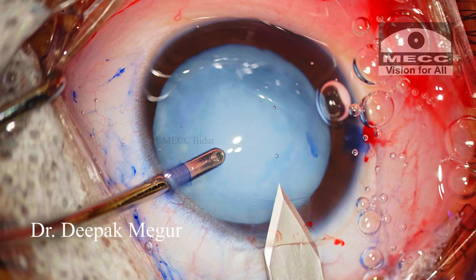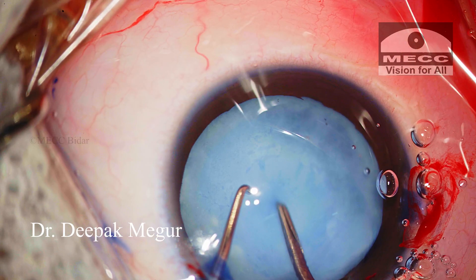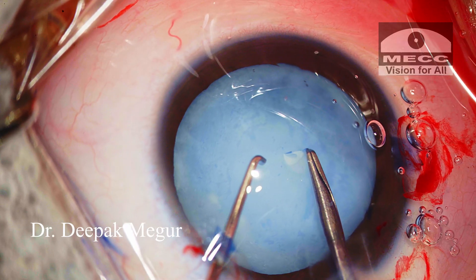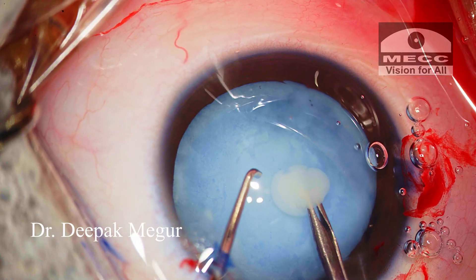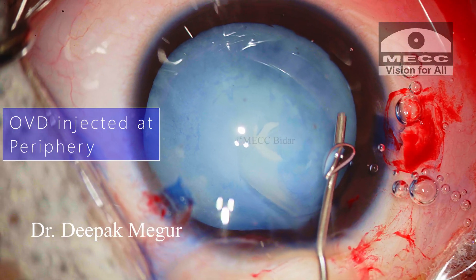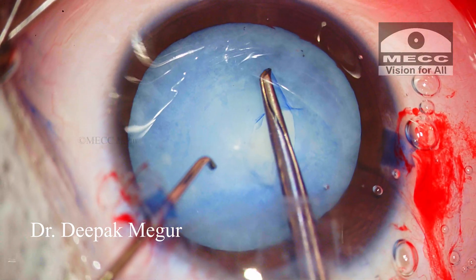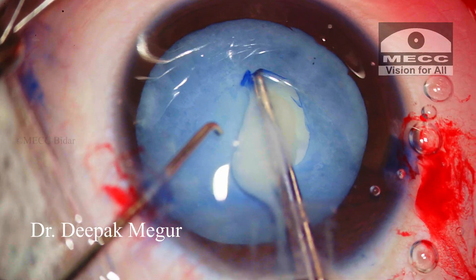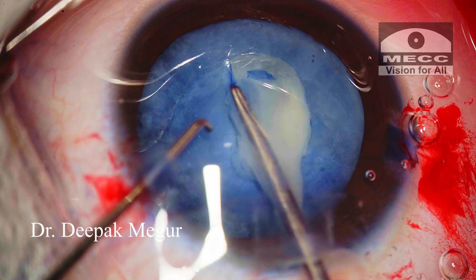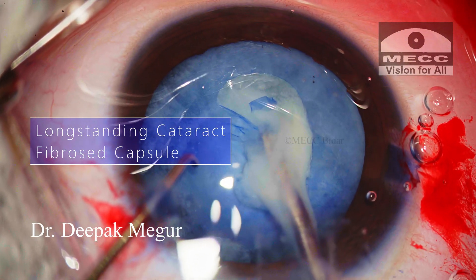After creating the main incision, I begin my rhexis with the forceps. As soon as I puncture, the liquefied cortex escapes out, obscuring visibility. The OVD is placed in the peripheral part of the anterior capsule tear to squeeze out all the liquefied cortex. I can sense that the capsule is quite thick and won't tear very easily. This is a long-standing cataract and it would have induced significant fibrotic changes.